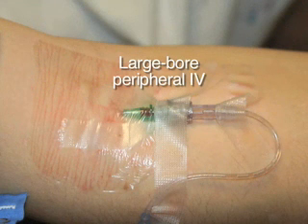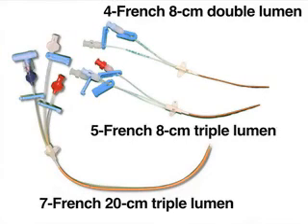central venous lines. For small adults and children, or for those in whom access to the jugular vein is difficult, 5 French and 4 French catheters can be used.